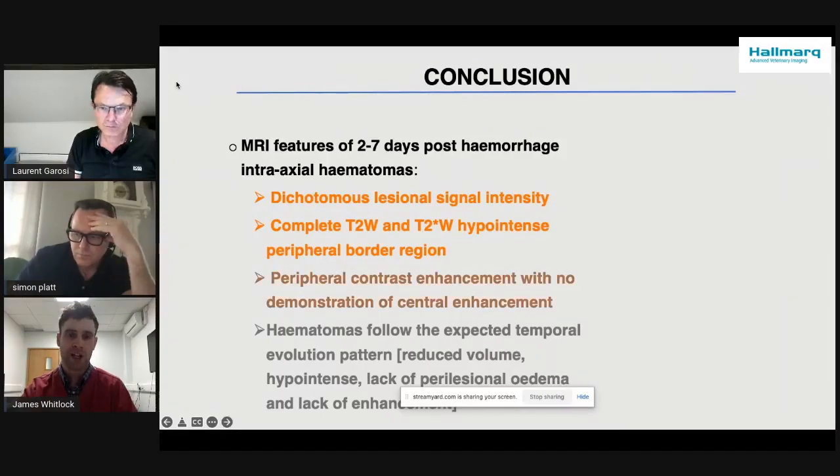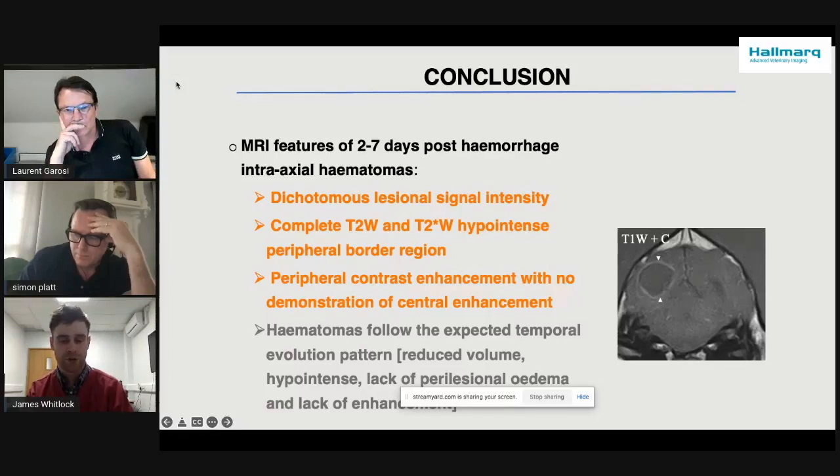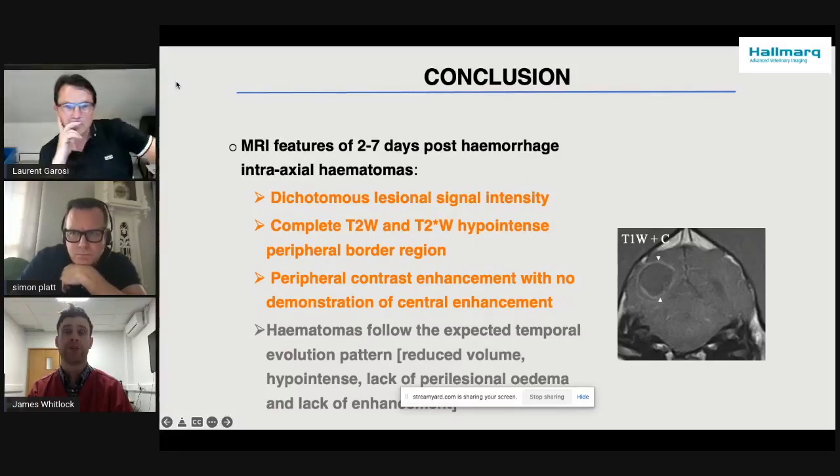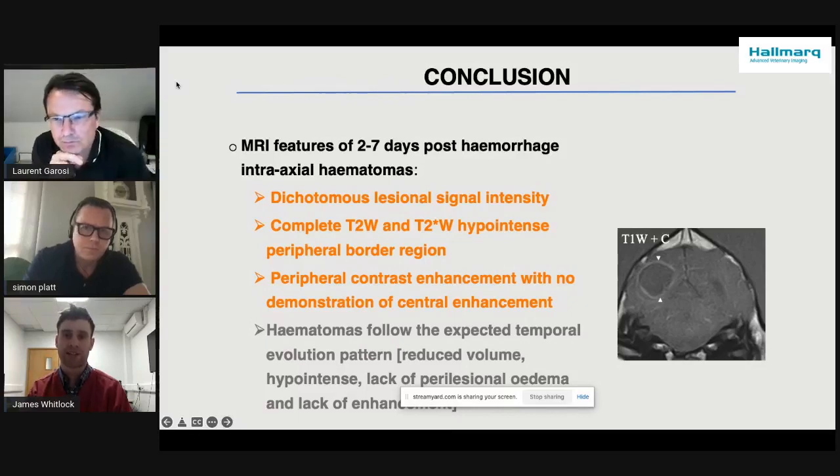And then looking at the enhancement, the peripheral enhancement with the hematoma lesion. What they've found in canine experimental models is that typically over 4 to 7 days following intracranial hemorrhage and hematoma formation, a very thin fibrous capsule forms around the hematoma lesion, and within this capsule they've got new capillaries. On histopathology they correlated this fibrous capsule to the area of peripheral enhancement that they see. That was done in a CT study, and it's likely that what we're seeing on MRI reflects that as well.